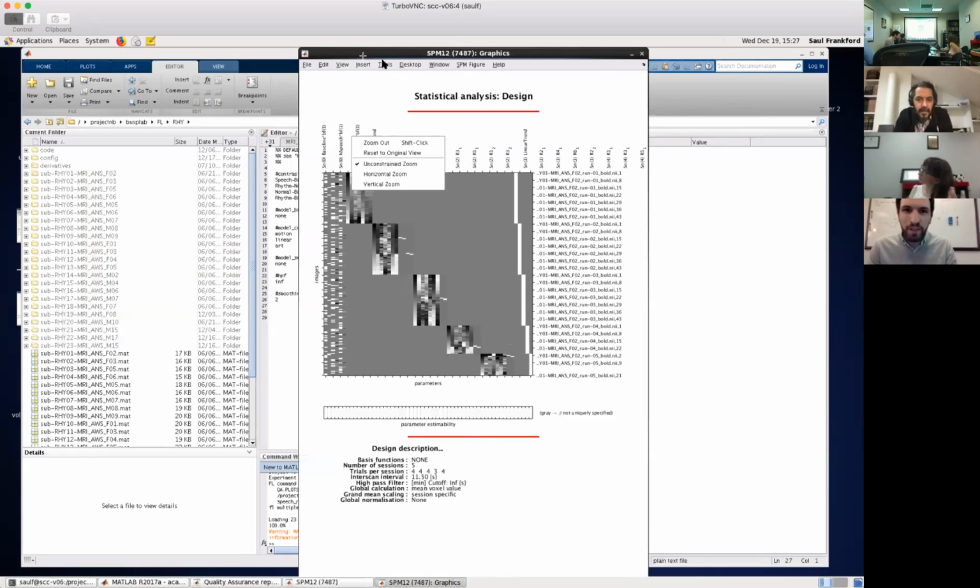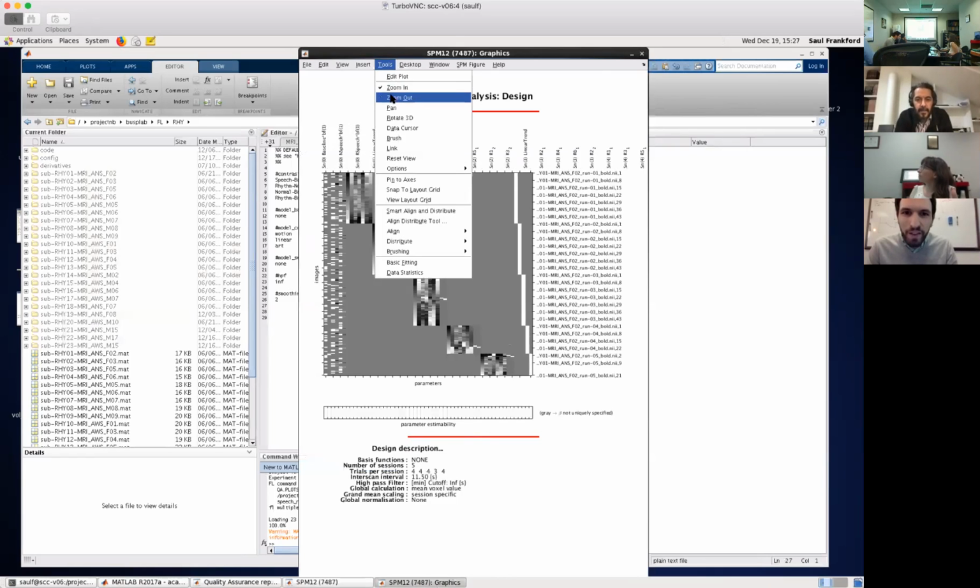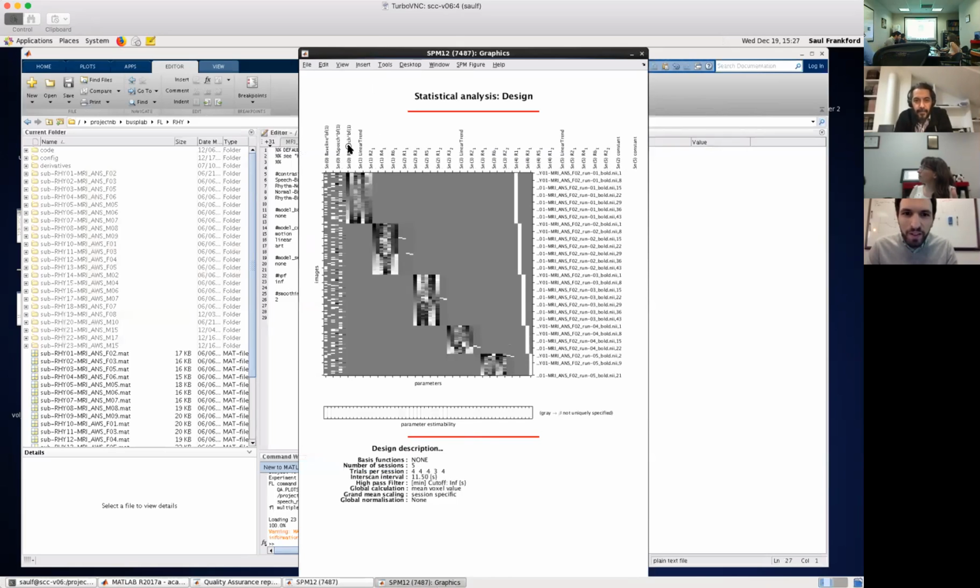Well, okay, so this is not doing exactly what I wanted. Let's just do that one. Okay, so the first 6 regressors on the left have to do with these. This looks like baseline. Right, so you will have the 4 conditions that you created and then the 2 parametric modulator effects. There's a parametric modulator for the normal and one for the rhythmic speech.